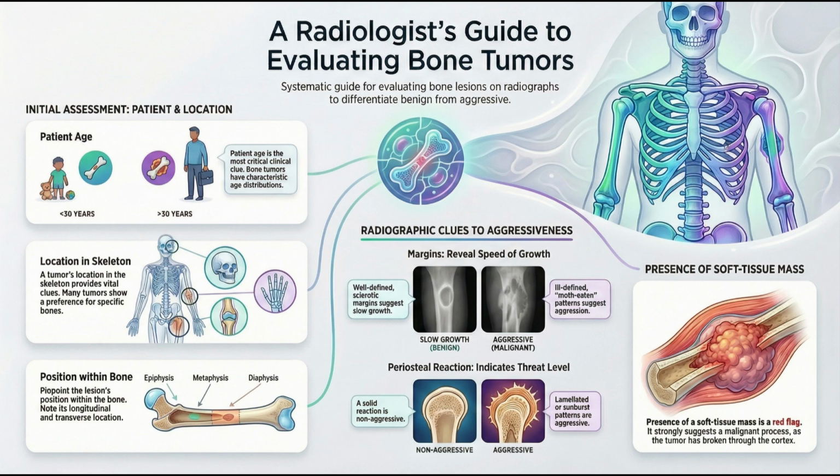The X-ray is literally the single most powerful tool in determining the entire clinical trajectory. It is the primary blueprint. It contains vastly more information than just spotting an abnormality. It predicts the biology, it stratifies the risk, and it determines whether the patient is safely observed or rushed to the oncology suite. It's just incredible to realize how much prognostic and diagnostic information is packed into that initial conventional radiograph. We started with what seems like a simple image, and by systematically applying these filters like age and location and decoding the tissue characteristics and aggressive patterns, we've unlocked a whole management strategy.